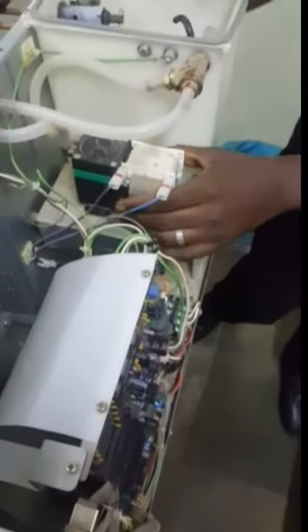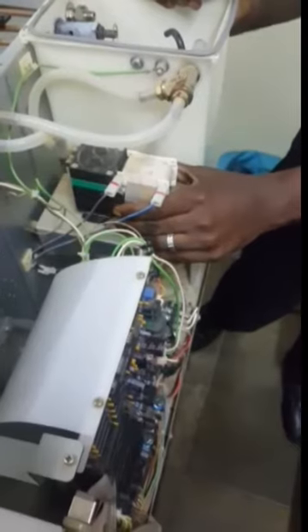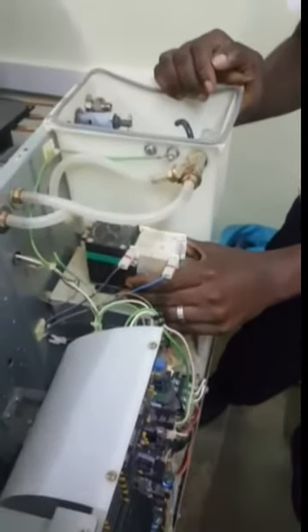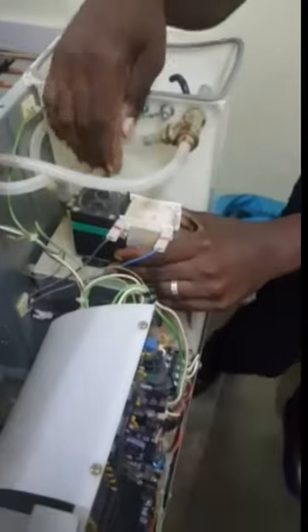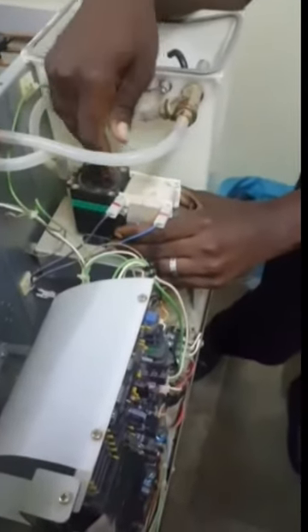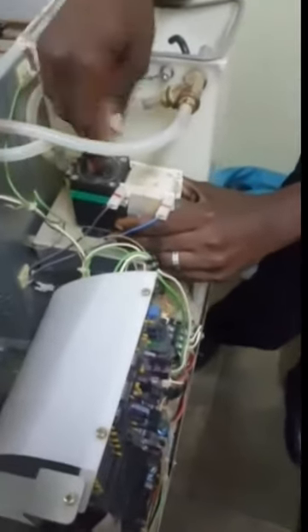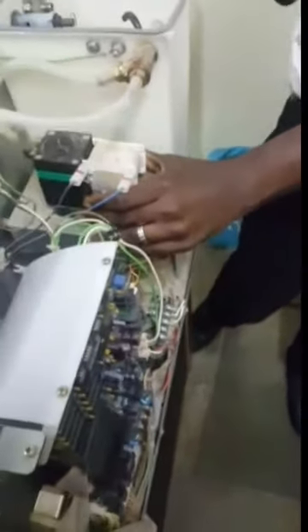We also have another part which keeps failing on a regular basis — that is the pump. Because of the pressure on it, the pump is supposed to be serviced once every year. But the parts for servicing it are not easily available, so we are not able to service it the way it is supposed to be. At the end of the day, it gets worn out, and the manufacturer recommends replacement.